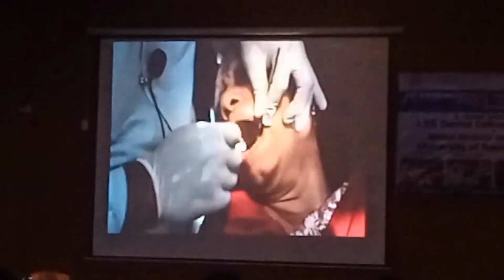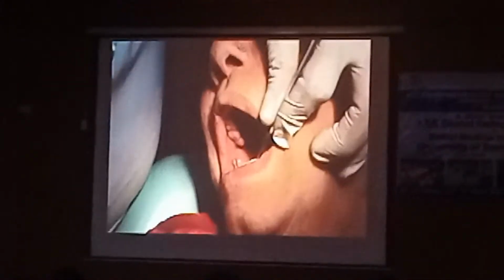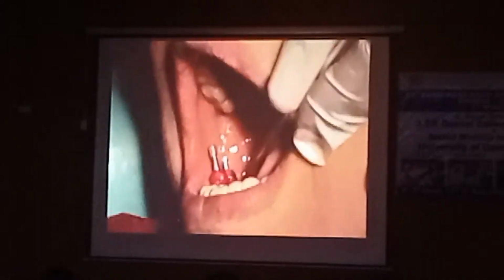So here I am doing it with composite. Do we have this thing already there? Curing light? Almost there.